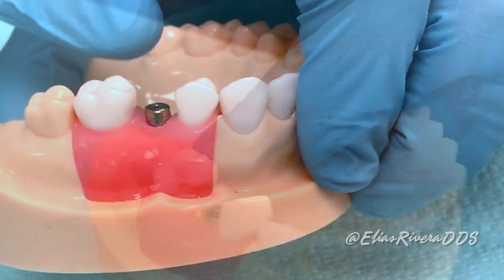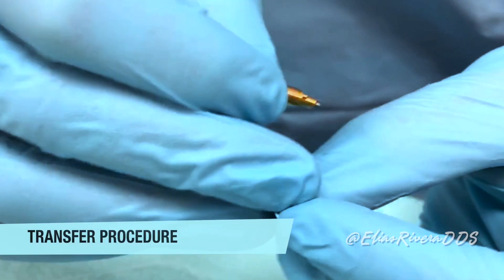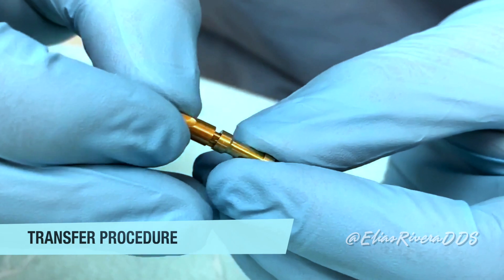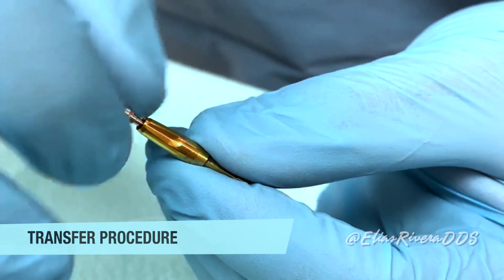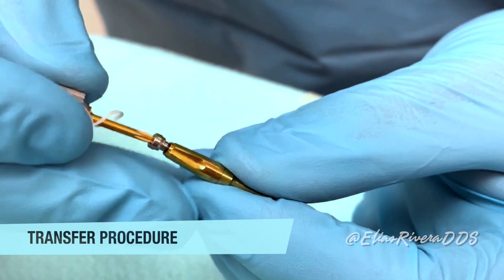Immediately replace the healing abutment — the patient can now be discharged. Step number five: attach the impression coping onto the corresponding implant replica or analog and ensure accurate seating. You can use the screwdriver to help seat it tightly.